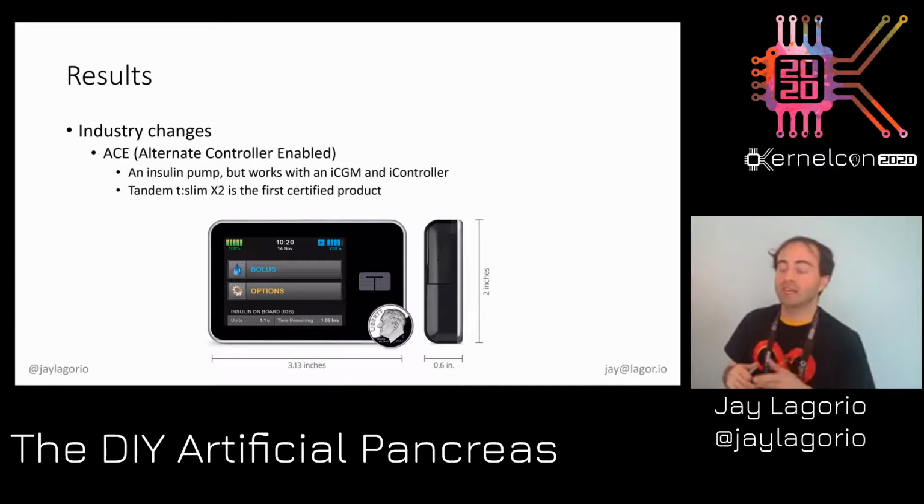And what's really impressive about this device is it is field upgradable with new software. The one that I use is burned in ROM. This thing, you hook up a USB stick and use their installer. And they have been delivering features for this thing over the last few years that way, which is pretty cool.